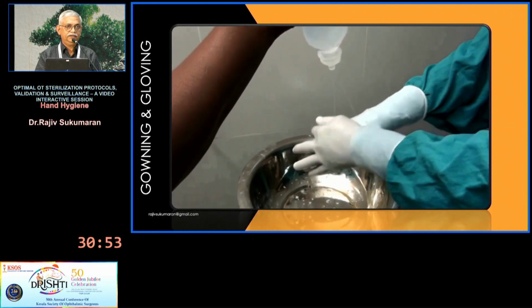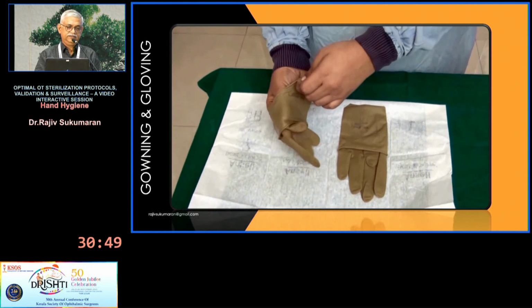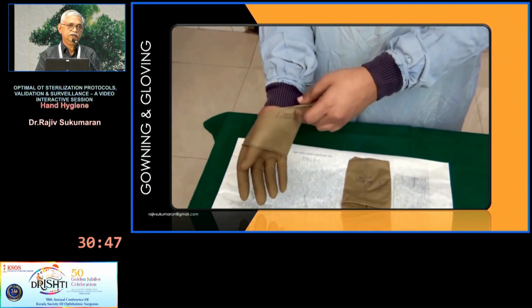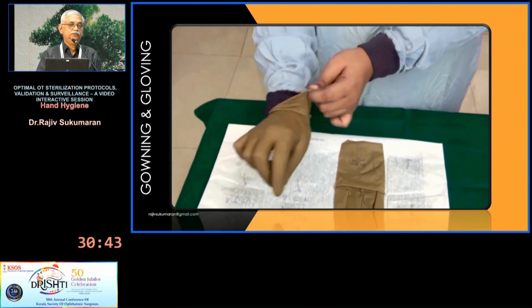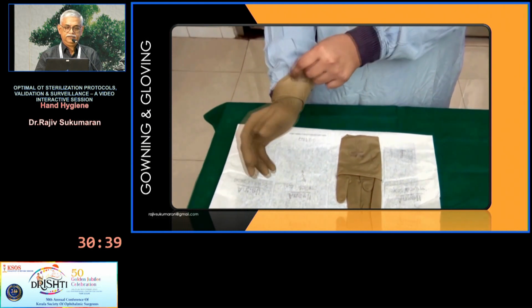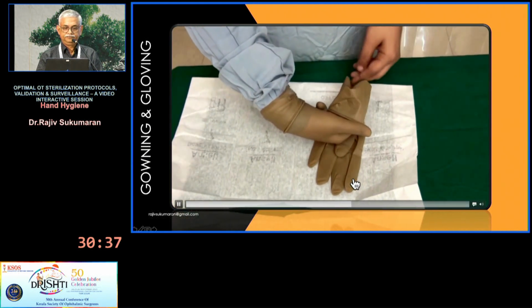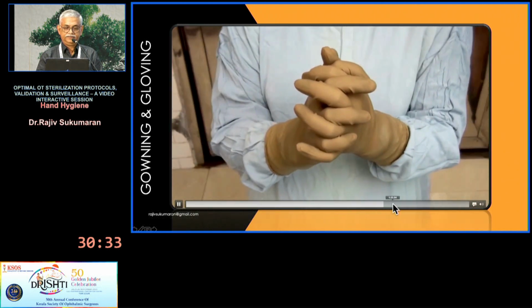But what is recommended now is the powder-free gloves, which are the nitrile gloves, recommended for ophthalmic practice. This is the way of using the nitrile glove. The same method we follow. And that's the way it is done.